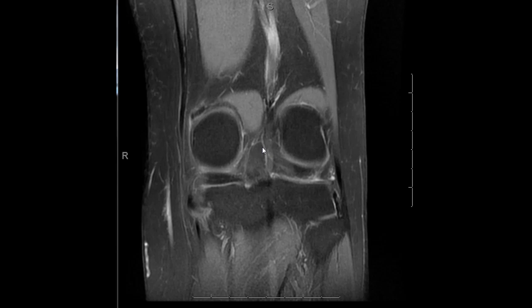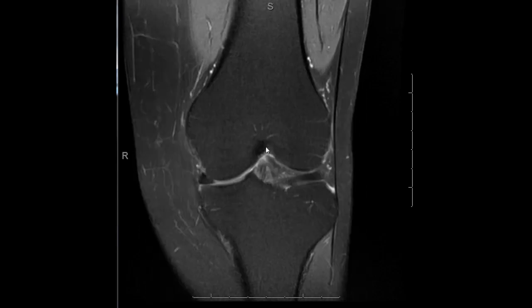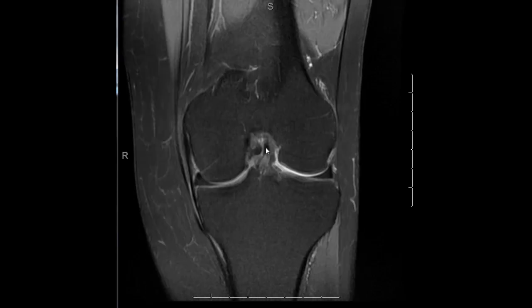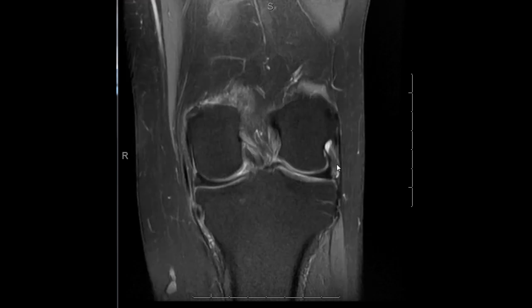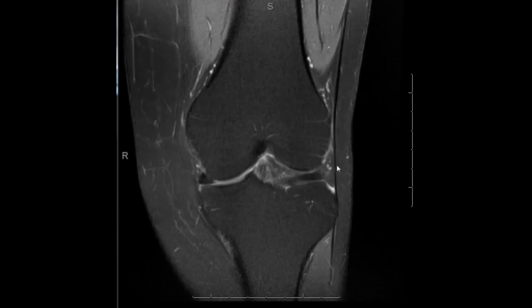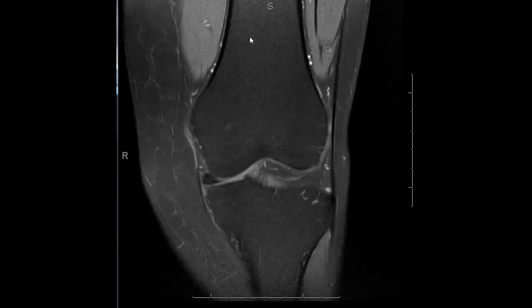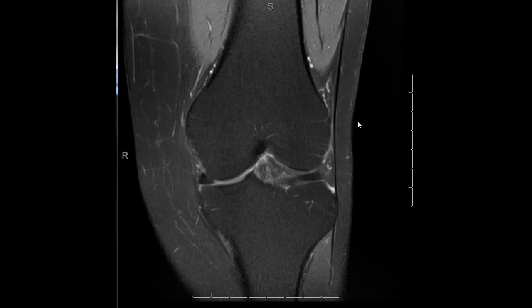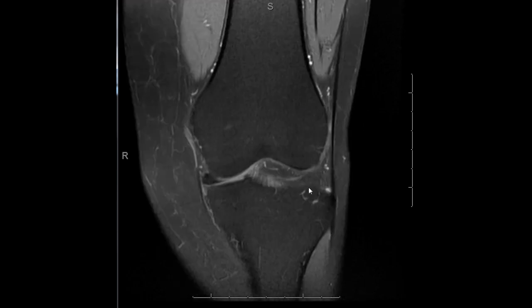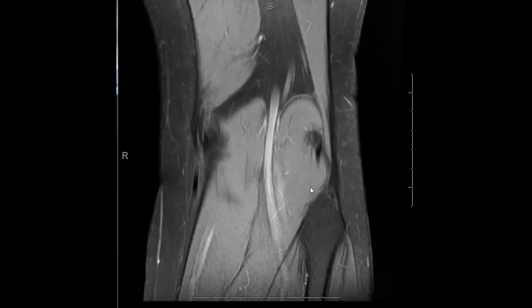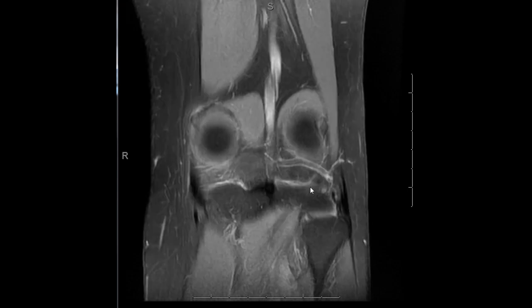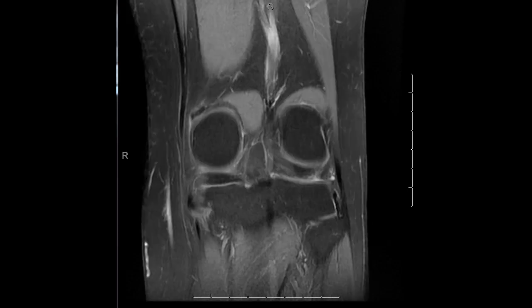Finally, at some point in your evaluation, you have to look at all the osseous structures. Some people look at this first; some in tandem with the cartilage evaluation. But it should be done at some point, ensuring you review the marrow signal, check that the cortex is not disrupted, and that there is no edema or evidence of mass. Marrow and bone are evaluated in all planes. Thank you.